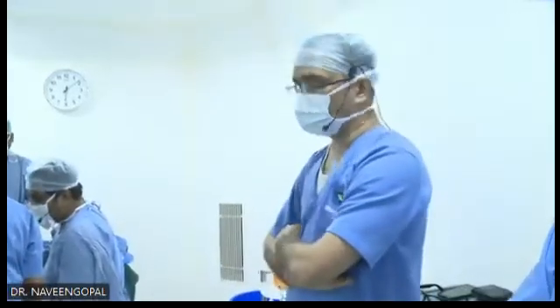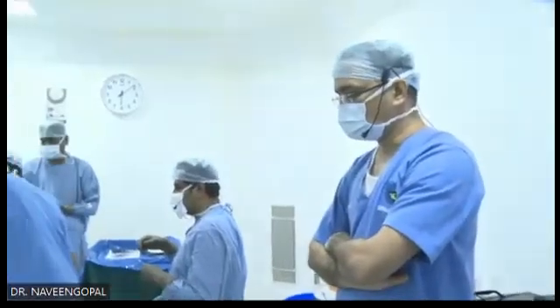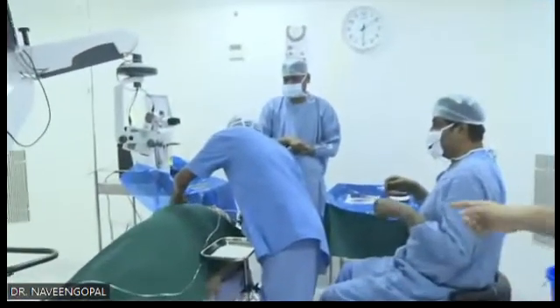Now we are going to show the process of multifocal insertion.